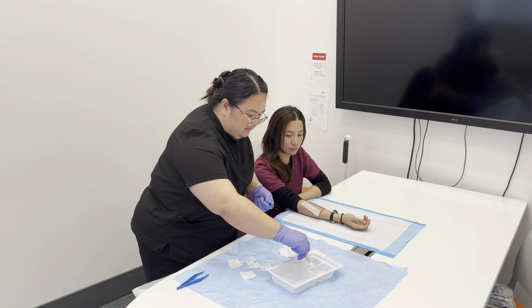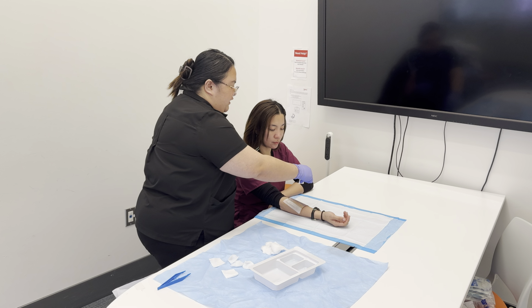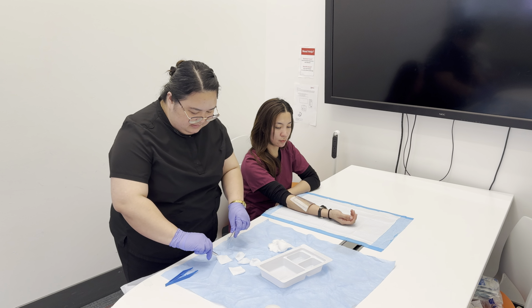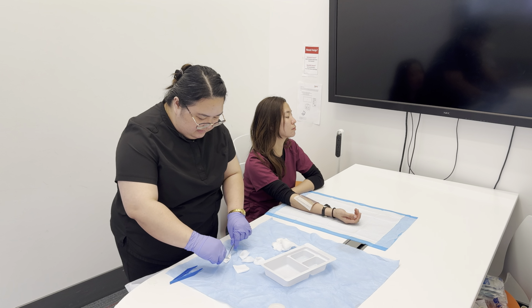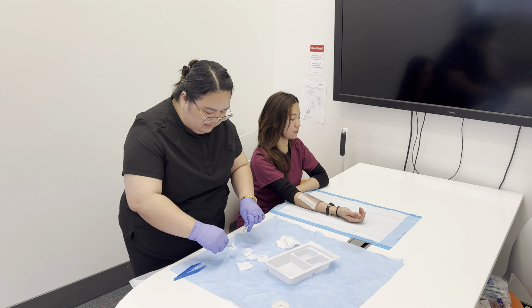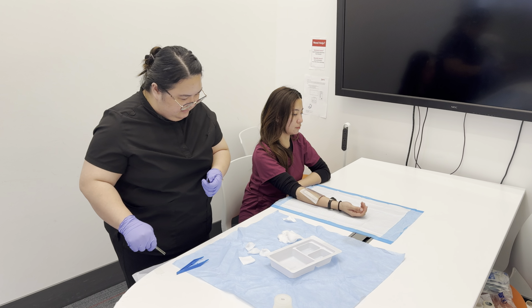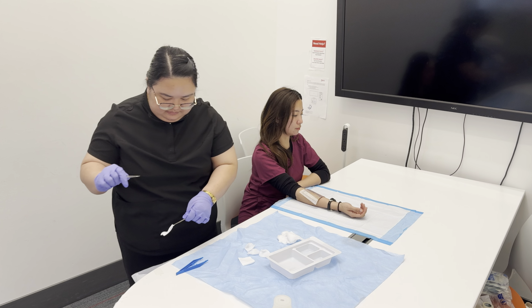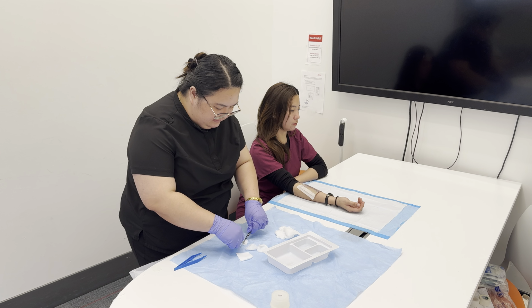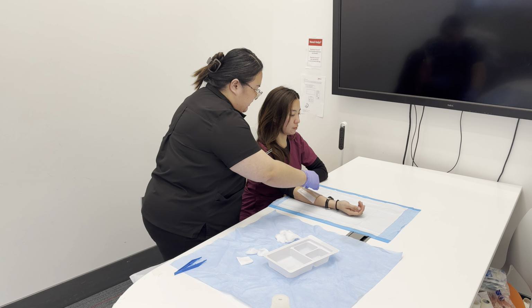And then in the wet saline, clean it from the farthest away from me. Okay, next. Clean it closest from me. Next. And in the midline.